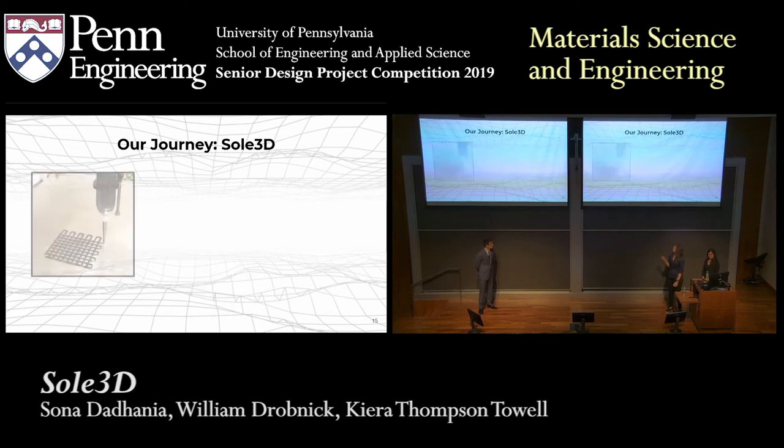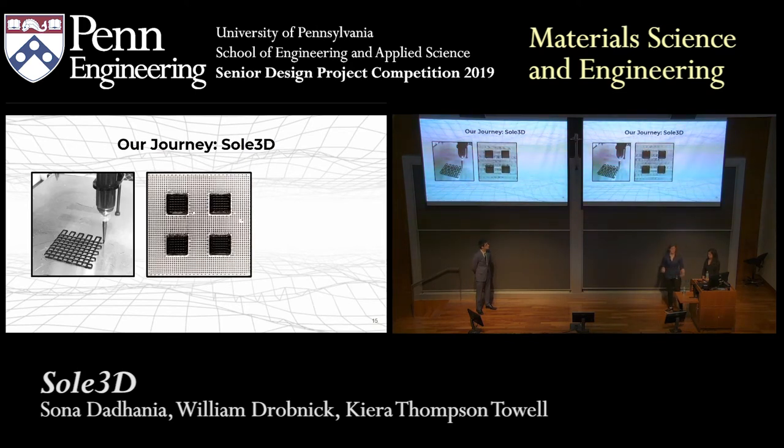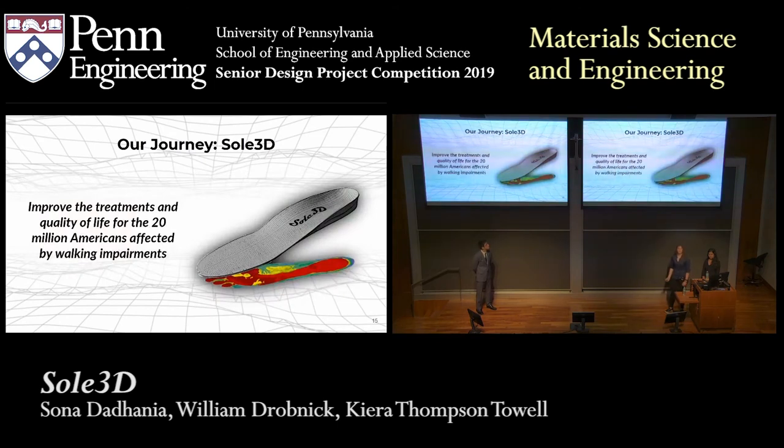To wrap it all up, we created a printable conductive composite that we printed into a piezo-resistive sensor. We demonstrated that it could be scaled up into a larger array to make a pressure distribution map, and we confirmed that we were able to get an accurate load reading with our sensor. With our technology, we will be able to improve the treatments and quality of life of the 20 million Americans affected by walking impairments. While we applied this to shoe insoles, it could also be applied in many other areas such as seat cushions to measure ergonomics or posture, or in football helmets to measure concussion forces. We demonstrated proof of concept and are actually looking into getting a patent for our material right now.